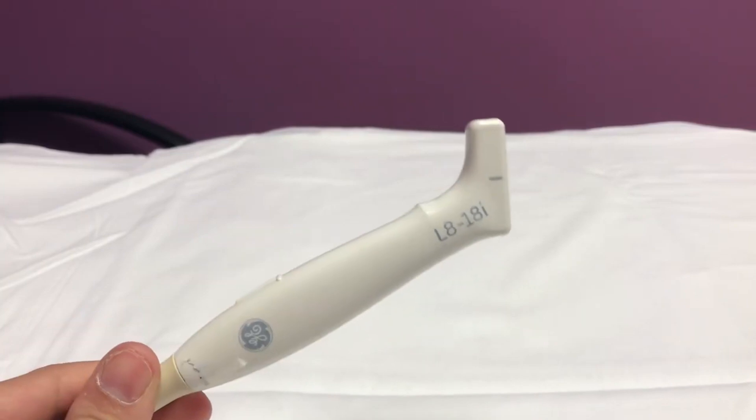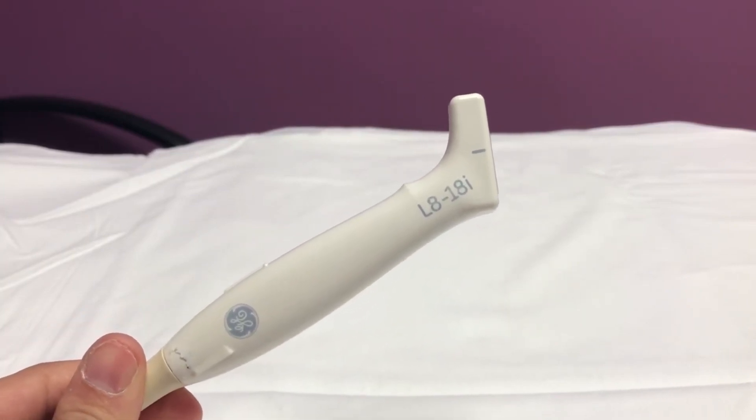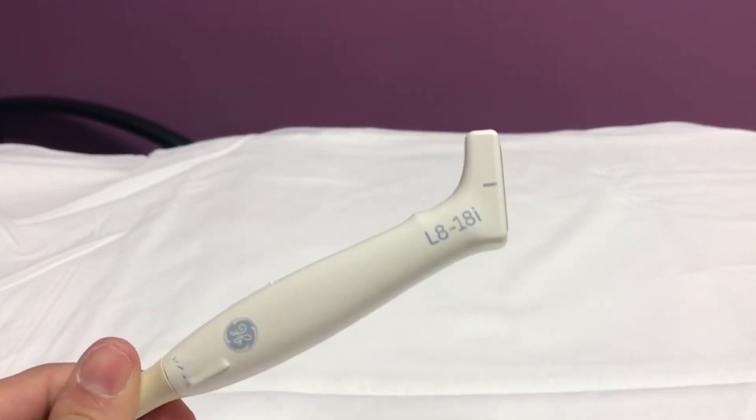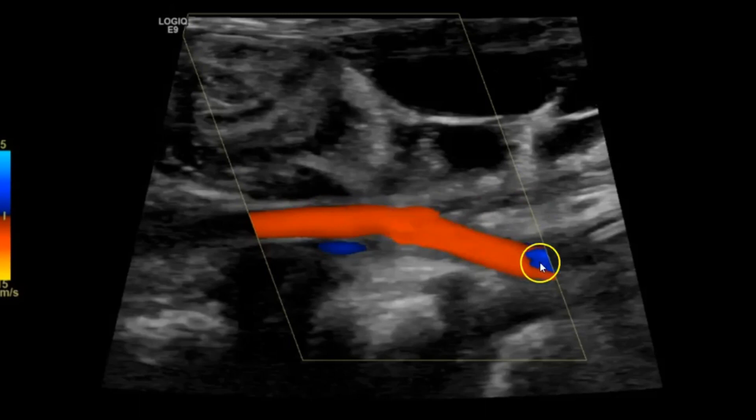I also use this for vascular — arterial and venous dopplers on babies, premature babies and congenital cardiac infants. I use this for their legs because their legs are tiny. I use it for the arterial and venous of the lower extremity as well. Much better resolution than the 9L, and the ML615 is just too large to use on their tiny limbs.